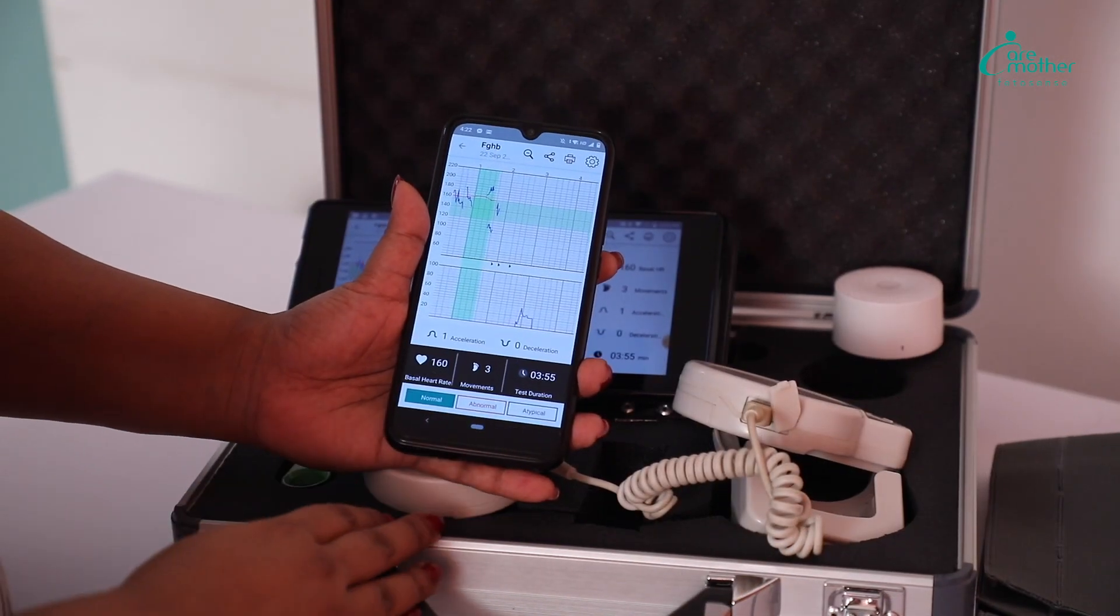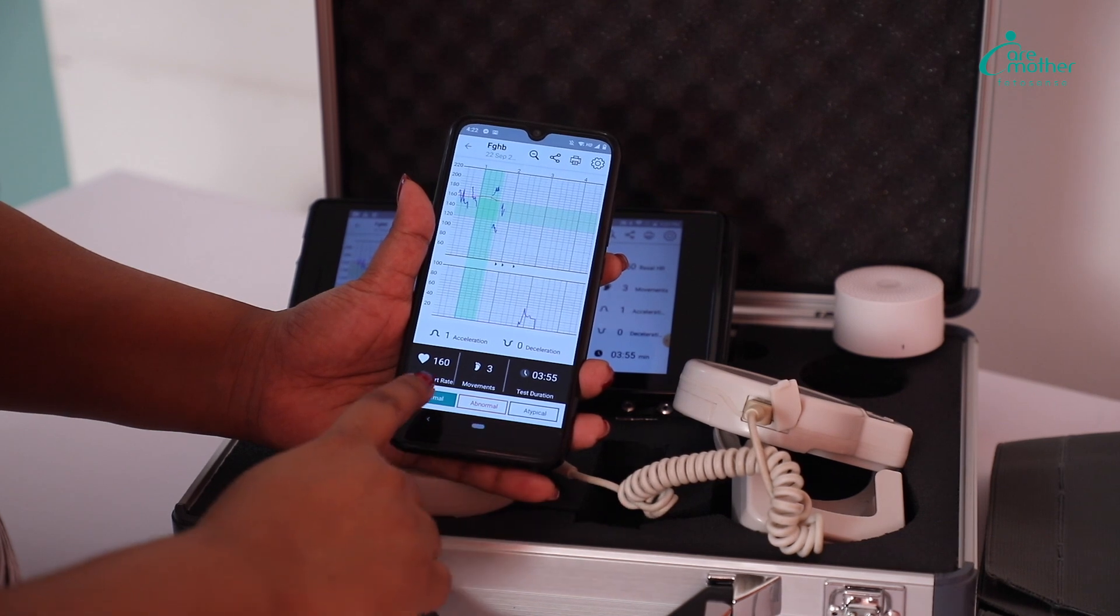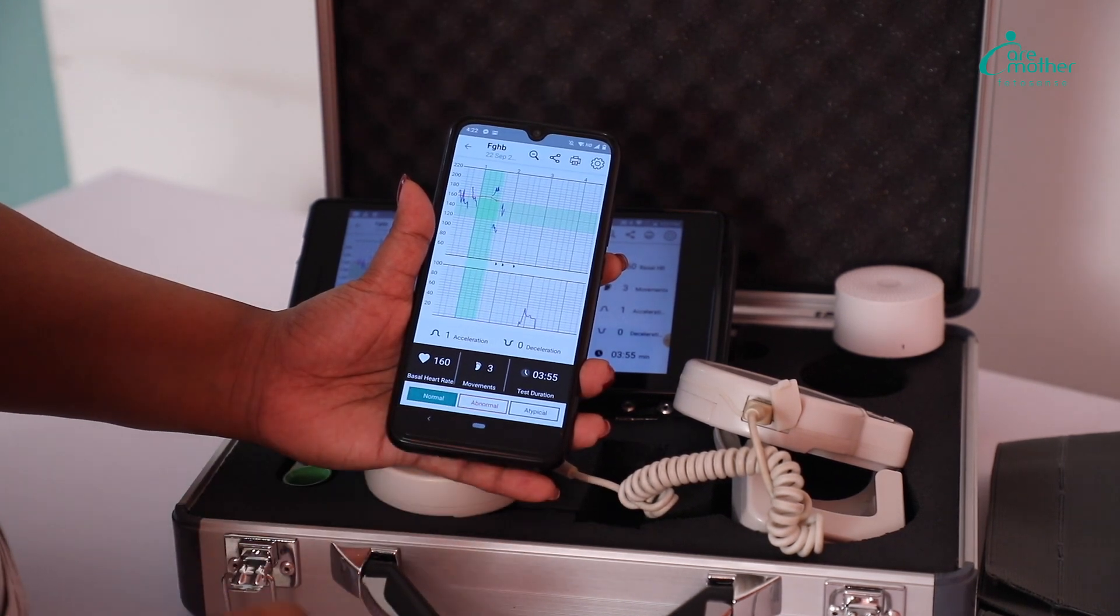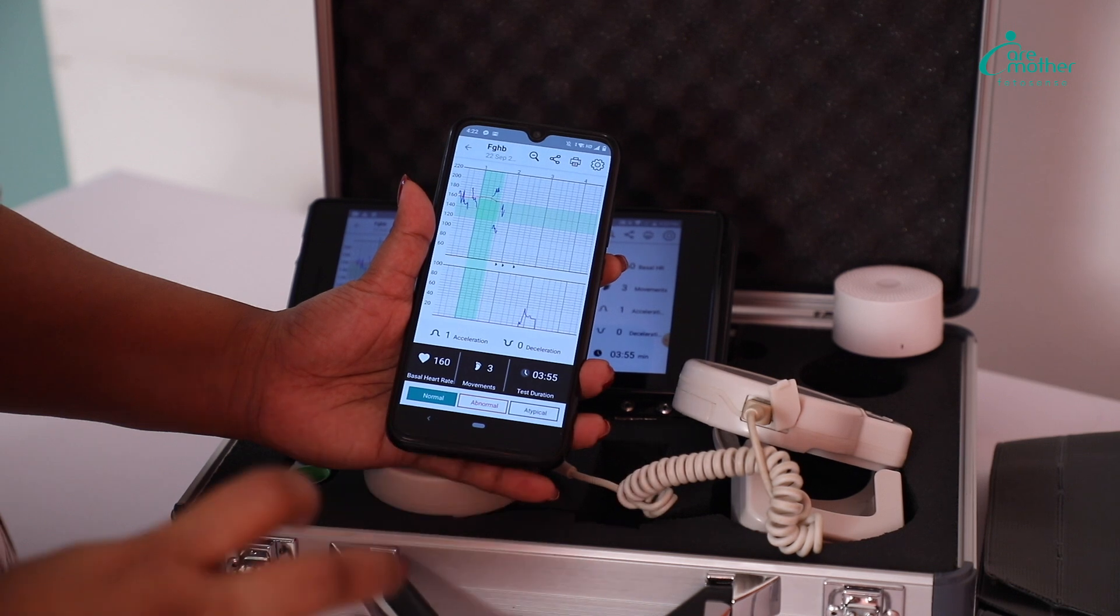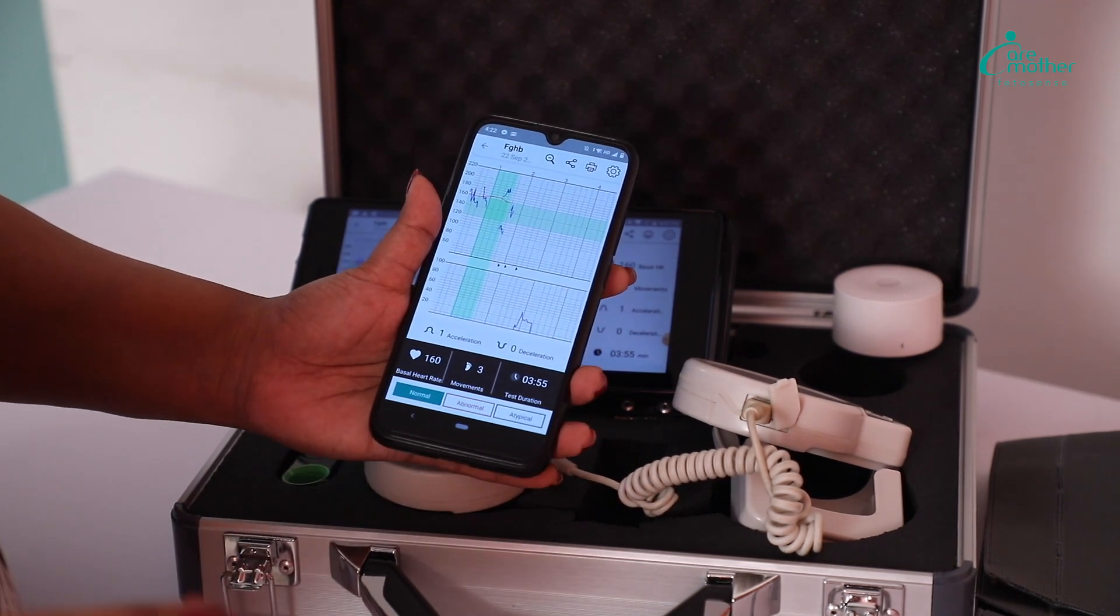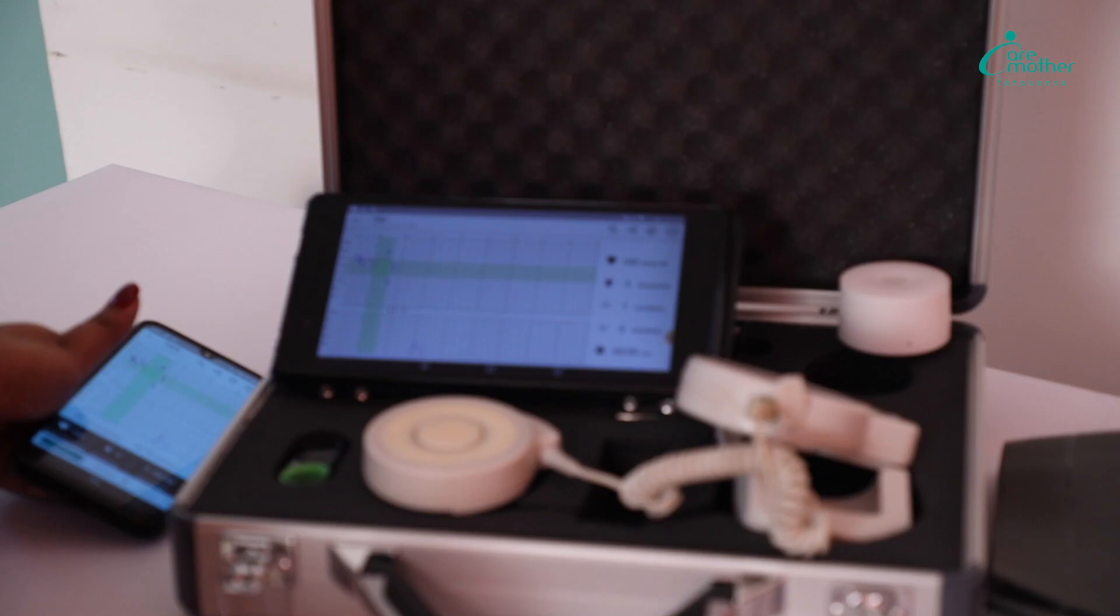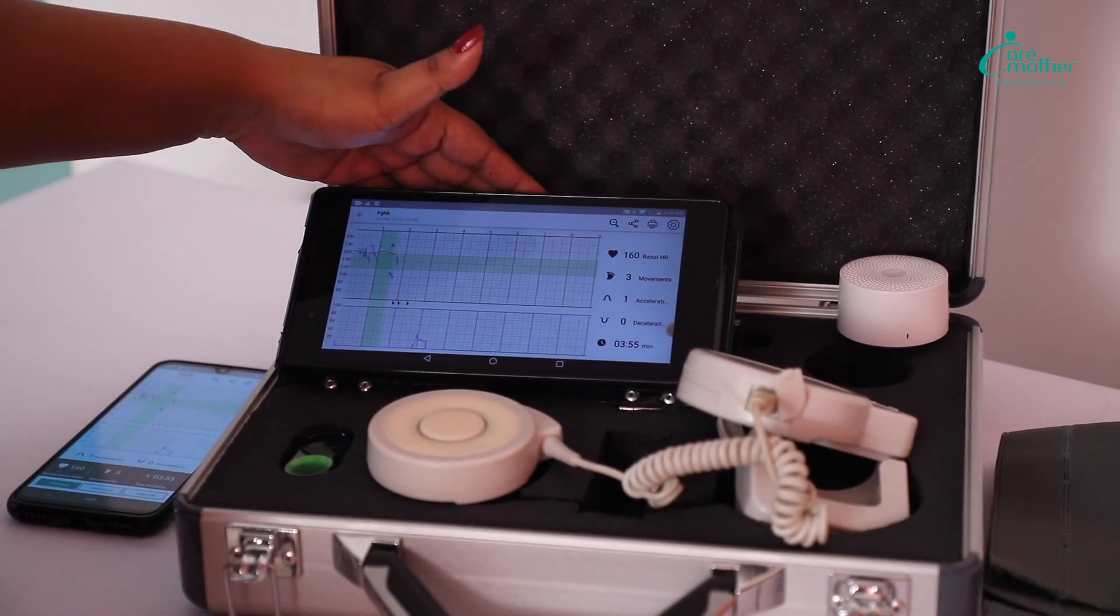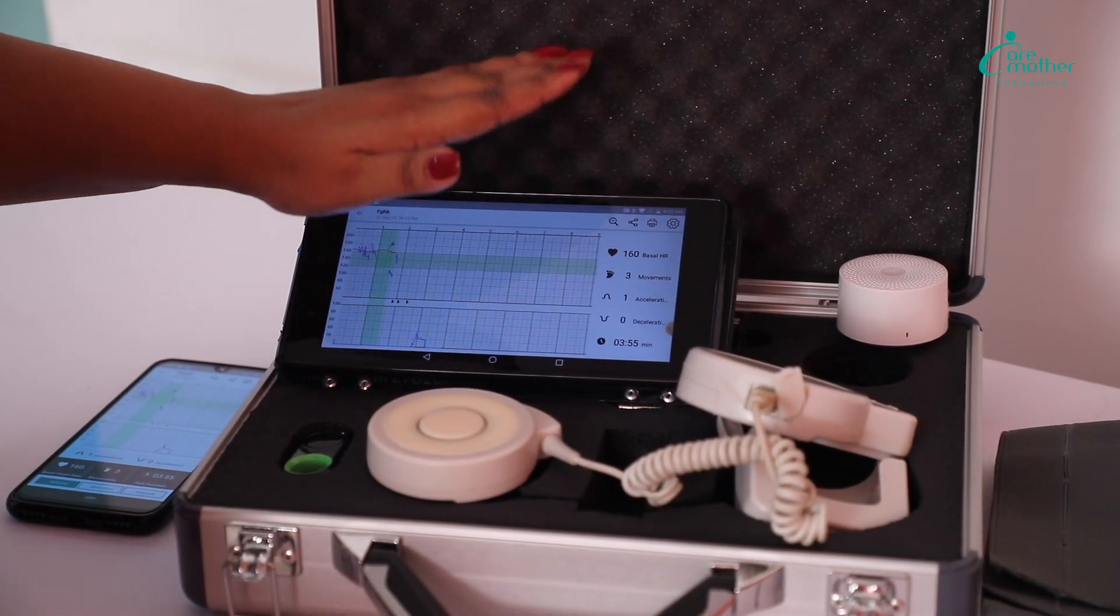After seeing the test, he can put in his comments using these tabs. That can be normal, abnormal, whatever he finds the test to be. And the moment he puts in his comments, the nurse at the facility or wherever she is with the device will be able to see his comments on this tab.